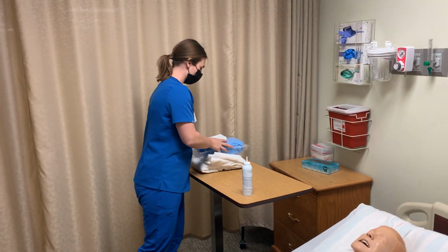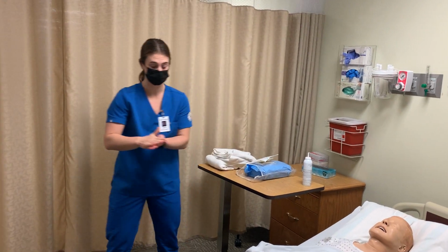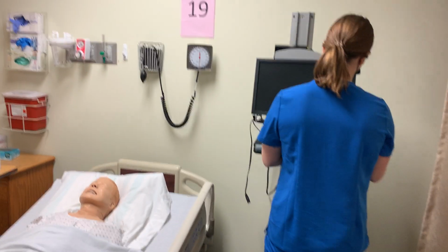How are you feeling today? I'm feeling alright. Okay. So, we're going to be placing a Foley catheter for you today. Okay. Before we start, I'm just going to go ahead and log in and make sure all of our information is correct.